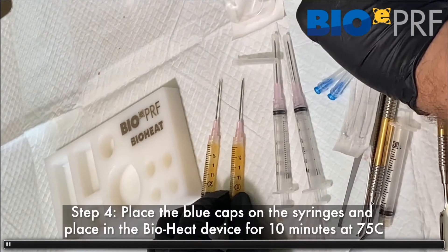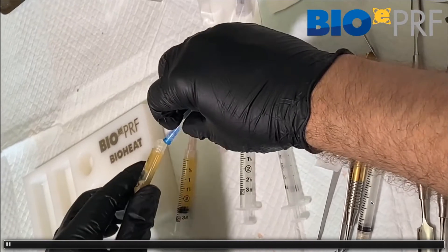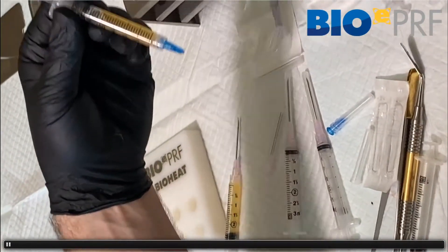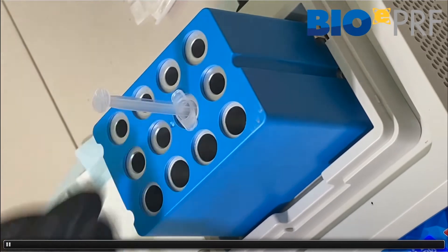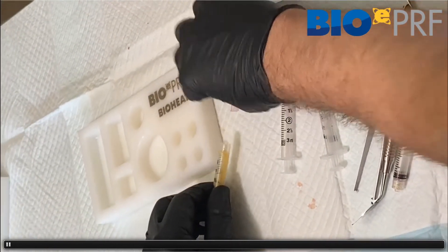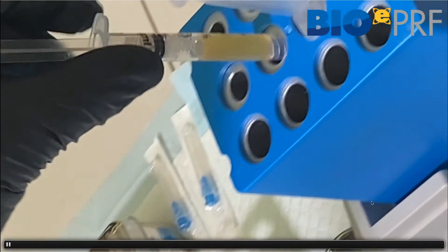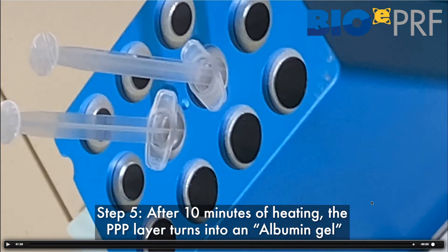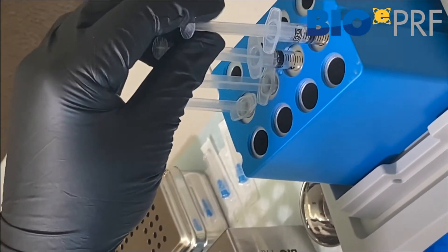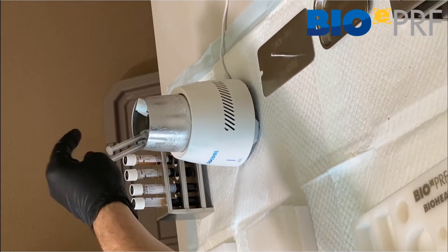Here come the blue lids. That's going to go in the middle layer, and that's obviously placed in the bioheat. Now we've got to wait the 10 minutes. During that 10 minute period, that's going to turn into albumin gel. When that's completed, we can then take out the albumin gel. You can see it's a different consistency. That's hot, so we can't mix it right away with the liquid PRF — we have to cool it.